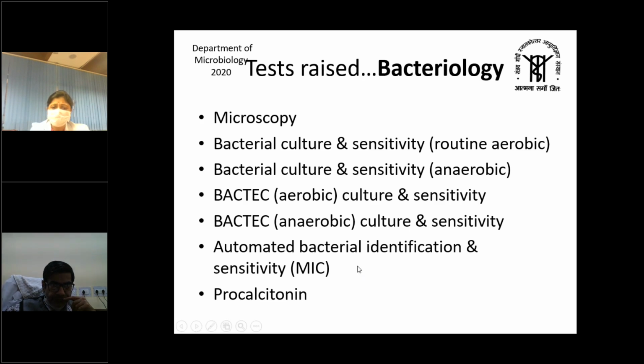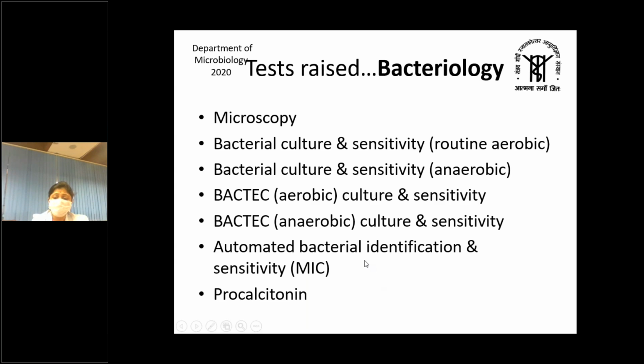There is another test, which is the automated bacterial identification and sensitivity testing, which tells us about the minimal inhibitory concentration. This is especially important for patients who are in the critical care ward, and monitoring of treatment or dosing of the drugs can have an important impact on the outcome of treatment.